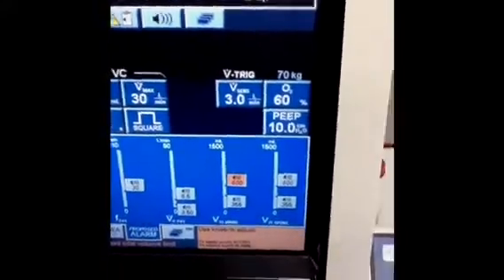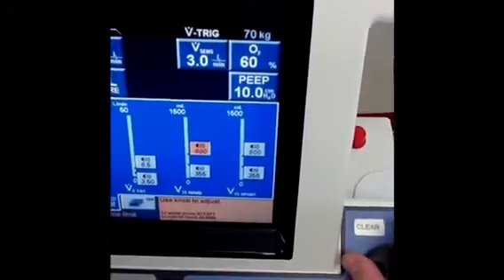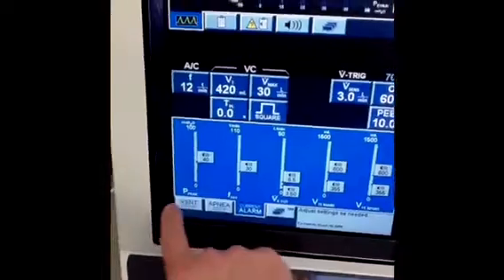This concludes the basic setup of the Puritan Bennett 840 for a new patient. Again, advanced concepts such as square versus ramp waveform have not been covered here. Thank you.